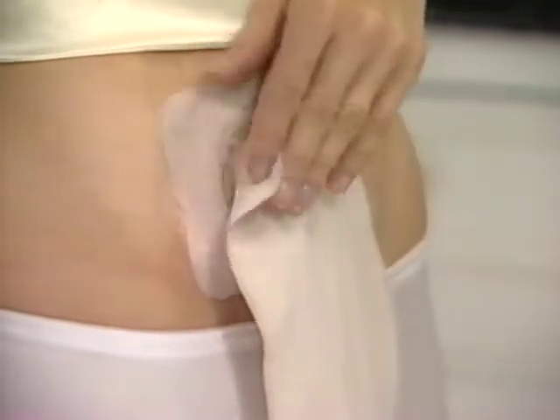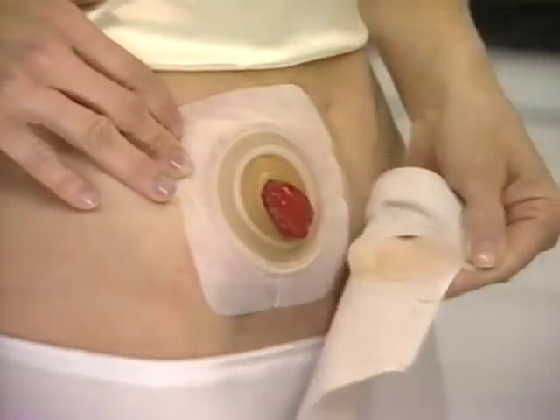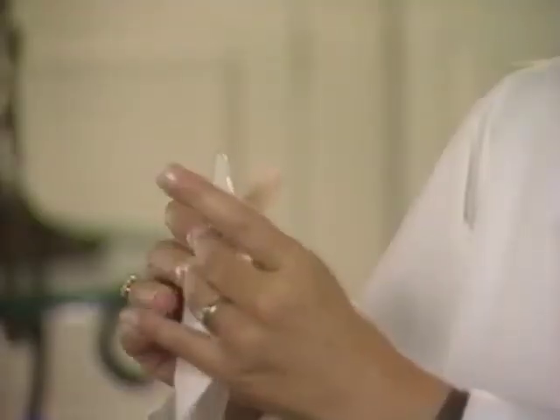To remove the SureFit Nutura pouch from the wafer flange, simply pull outward on the pouch tab and lift it off. Remember, it's going to take a little practice before application and removal of your ostomy system becomes routine. Until then, just remember to prepare everything you'll need in advance and take your time. As you get to know the SureFit Nutura ostomy system, you'll appreciate this unique safety feature. When you hear the audible clicks, you'll know it's locked into place.